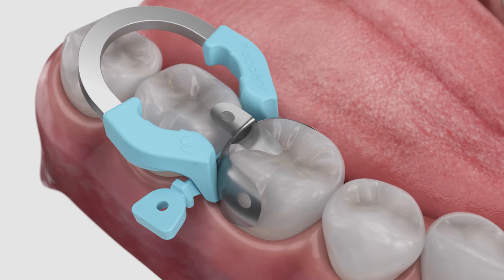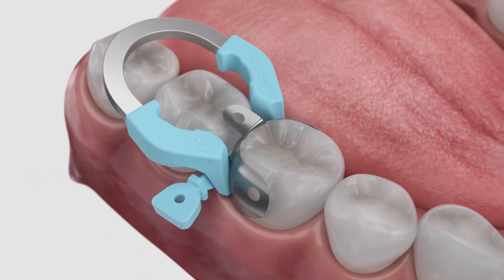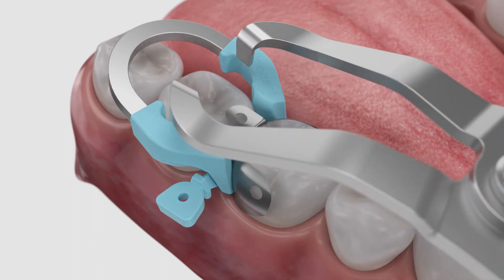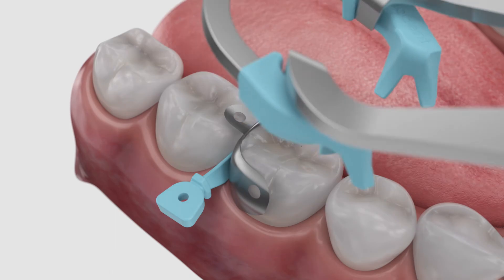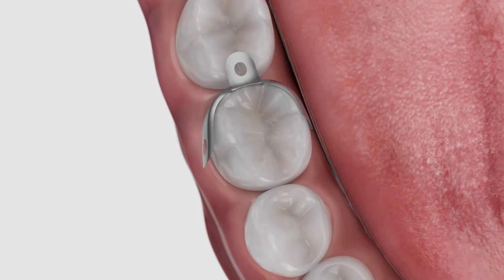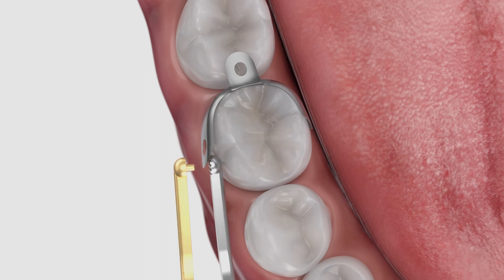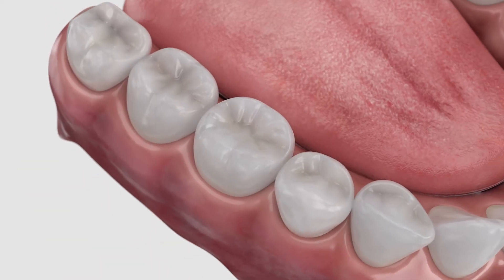Now you're ready to place the restorative materials according to the manufacturer's instructions for use. After the restoration has been properly placed and cured, remove the ring using forceps and the Wedge using pin tweezers. Use pin tweezers to grab the matrix wing hole and remove. Polish to completion.